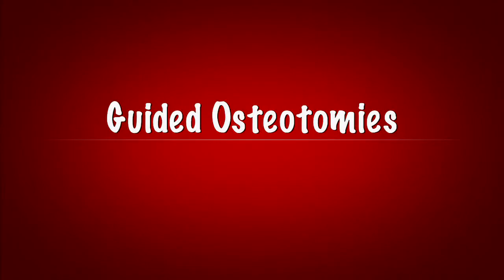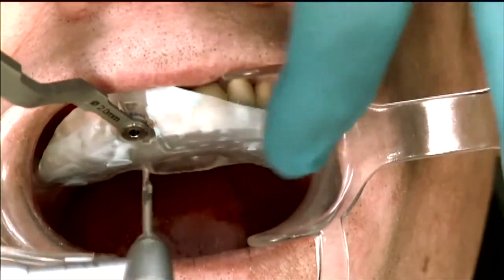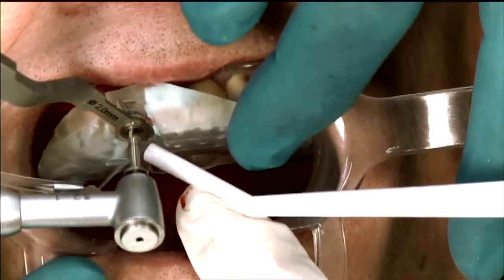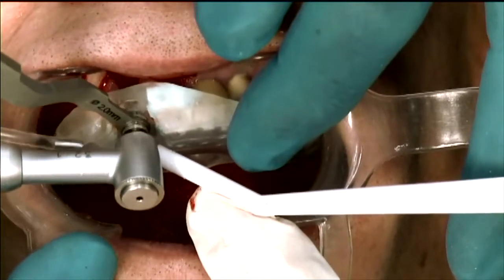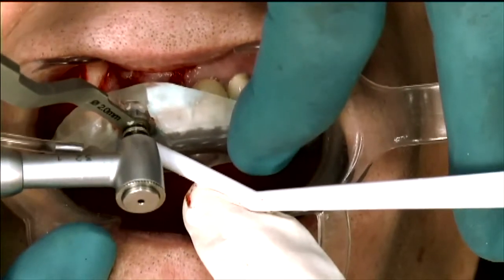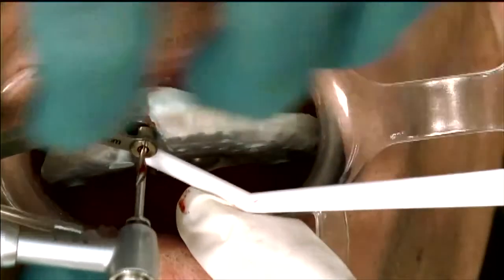We'll suction from the buckle a little bit, then go in all the way to complete depth. You can see how I'm burying it all the way. I won't go too deep, but I do a couple of pumps and then pop out.